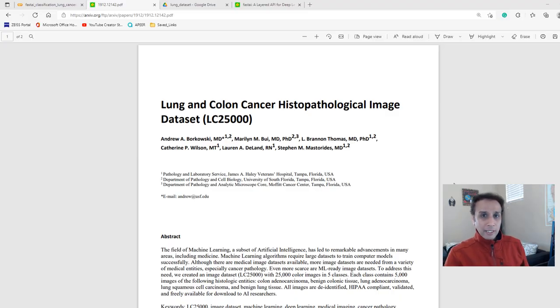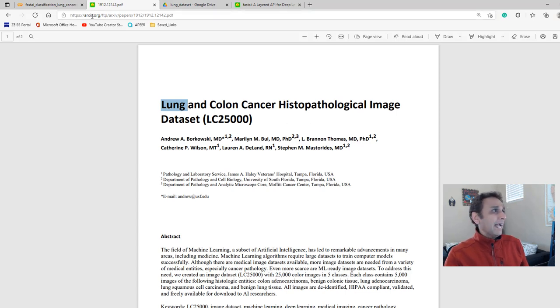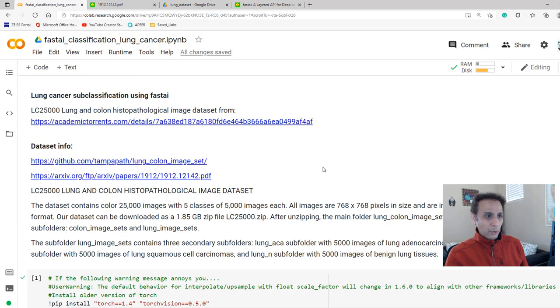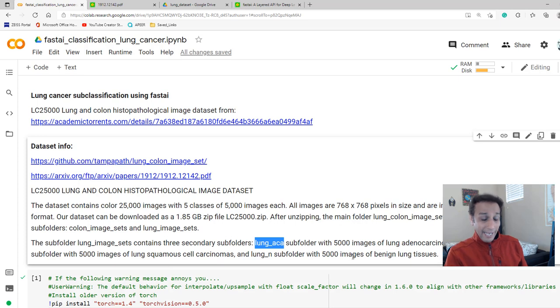Let me start by describing the dataset. We are going to use the lung and colon cancer histopathological image dataset, referred to as LC25000 — probably because it has 25,000 images. We're going to use the lung part of this. The lung dataset has three subclasses: lung_ACA (lung adenocarcinoma), lung_SCC (squamous cell carcinoma), and lung_N which is benign.